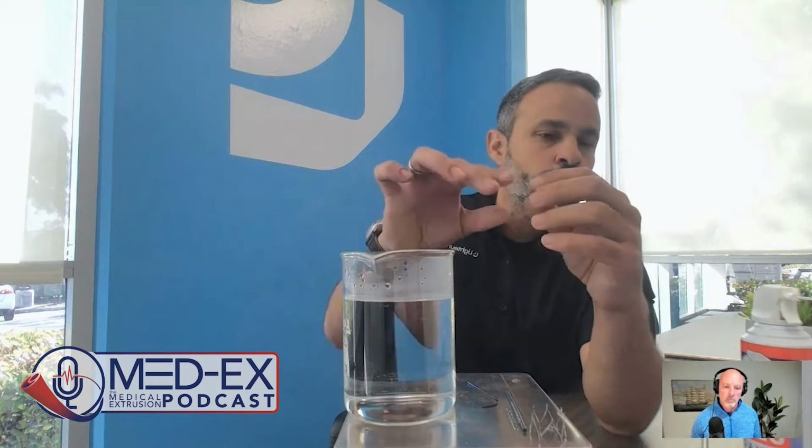First, Nitinol, you just called it the super elasticity. That's why we brought some samples in here, just to show that, right? Because it's not the same just talking about it as seeing it. So this is an example of a Nitinol cut heart valve frame. And when we say super elasticity, this is what we mean, right? It's super elastic, so it's really, really flexible. And right now, this one, we imparted this shape, right? So it's in this shape that it's going to create radial force to a vessel.